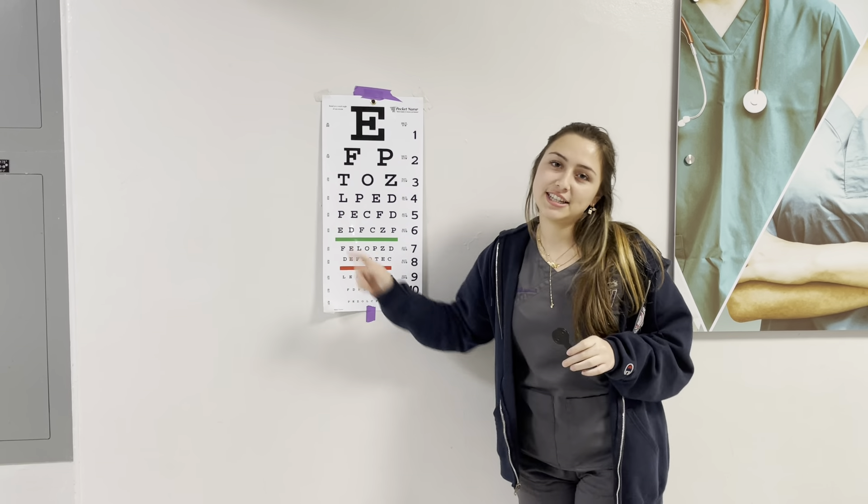P-O-E-D-F-O. Okay, great. Now go ahead and switch the occluder for me.